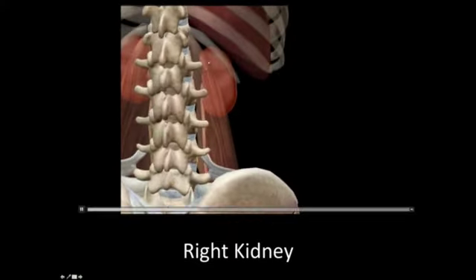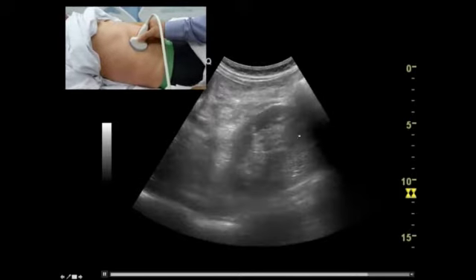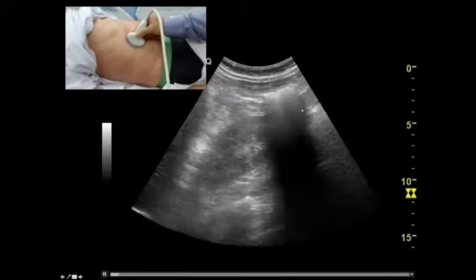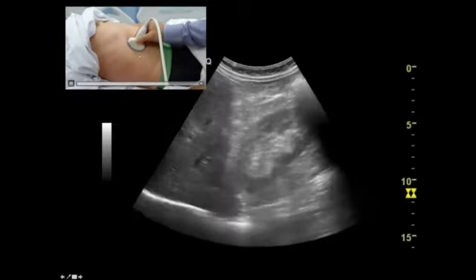here I am. Get the patient to breathe in and fan the probe one way, fan the probe the other way. So here, looking at this image, the patient breathes in, it brings the liver and kidney down. We fan one way and we fan the other way right through that kidney until we've seen it all from end to end. The lower pole here is being covered up by that bowel shadow and gas there. Okay, so you're fanning one way and the other.